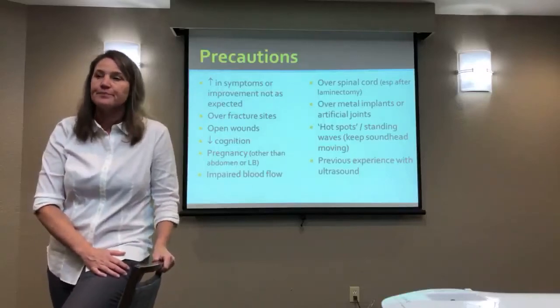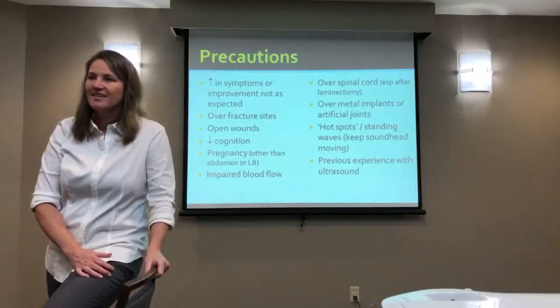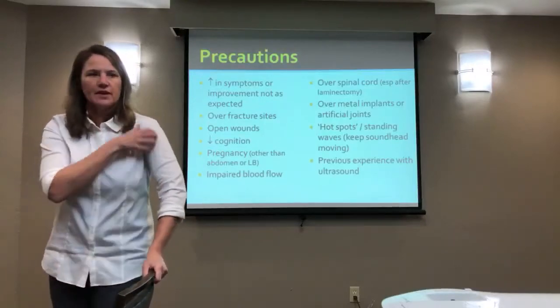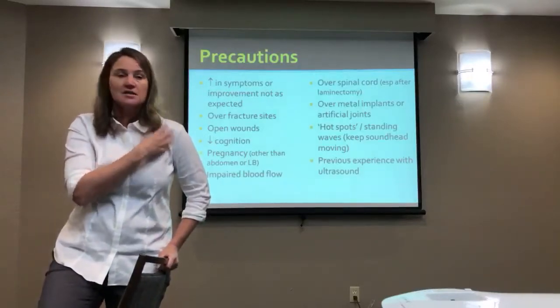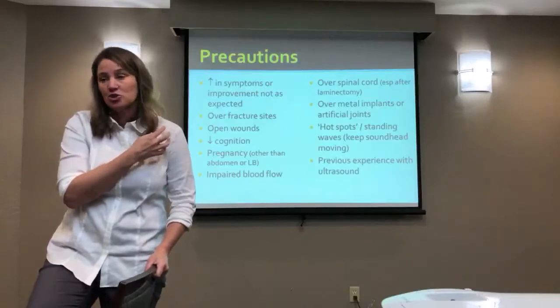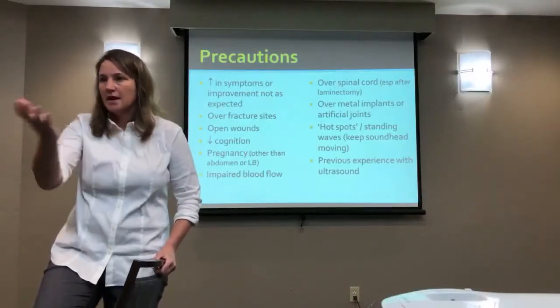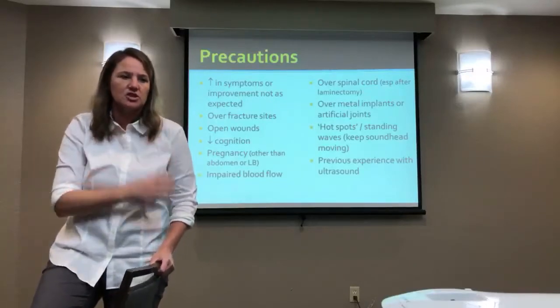So ortho, like a total hip or even a hip fracture, you'd want to be cautious. Let's say somebody had a knee replacement and you want to target one of their ligaments, or they had metal in their shoulder somewhere, and you want to target a ligament, a muscle or a tendon. The tissue of their body is your target. My question is, can you safely target that tissue and get benefit out of it? That would be my question to you, and where is the metal, or what's artificial and where is it, and can you safely target that tissue?